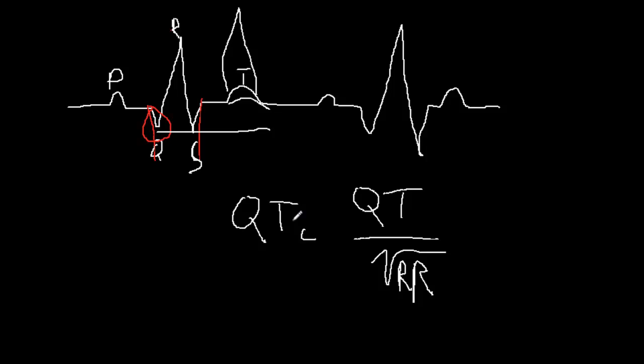Women have a little more room. Just in a clinical sense, a lot of times, especially if they're on a medication that's known to cause QT prolongation and it hasn't been a problem, people aren't really concerned unless it gets close to 500. So if you have a patient who's at 500 milliseconds QTc, you want to bring it up in a patient presentation because it's important.